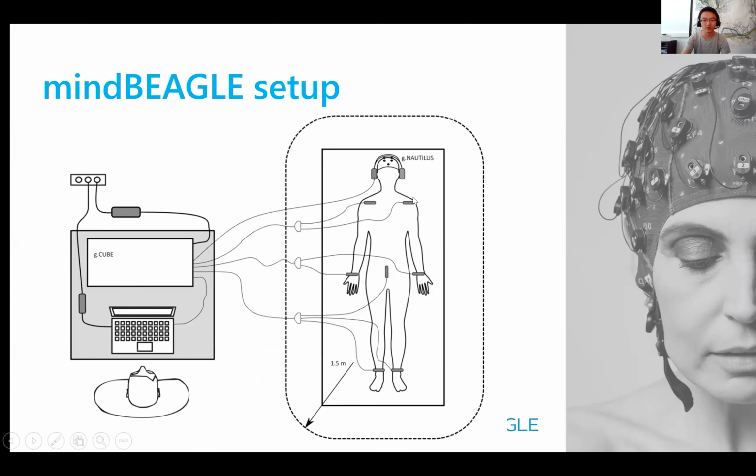There are also 7 vibrostimulus connected to the patient and also connected to the cube. They are placed on different locations, usually 2 on the wrist, 2 on the shoulder, 2 on the ankle, and 1 on the belly. These locations are chosen based on previous studies and experience. For example, usually the targets are on the wrist because the wrist has a good sensitivity of tactile sensation, and it also represents a large area in the brain cortex. The other tactile stimulators are placed far away from each other, so they can provide a good spatial distribution.